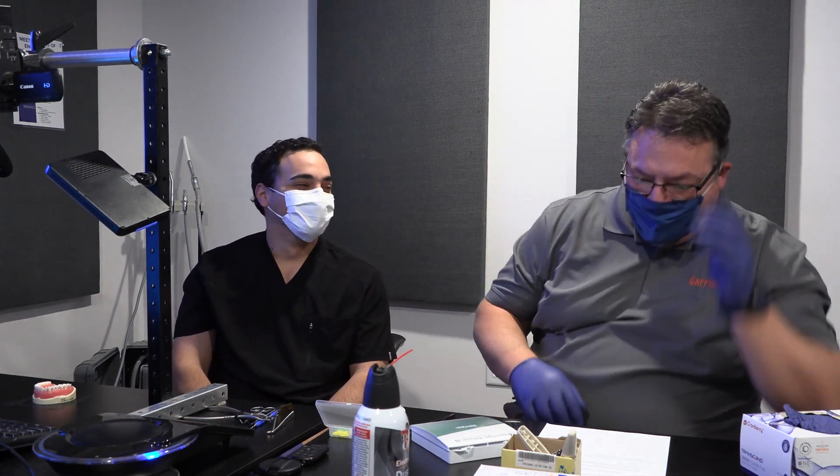Hi everybody. This is Kevin with Garrison Dental Solutions, and we are here today with the esteemed Dr. J.D. Corey. Dr. Corey has helped us along through the process of developing the new Fusion Anterior Matrix System.